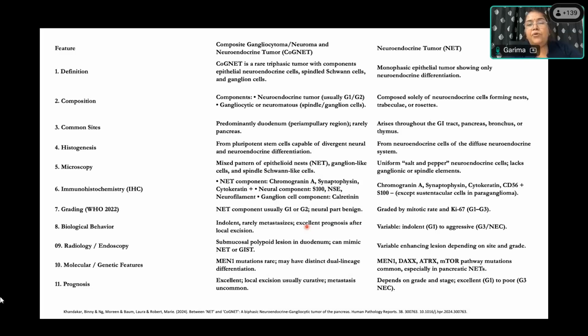Initially, the earlier term for this tumor was gangliocytic paraganglioma when I was a postgraduate student like you all. So we used to learn and memorize these entities. Sometimes you get lesions like this if some examiner brings us a slide like this, and this location is from the ampulla or duodenum. So this is one of the possible entities.